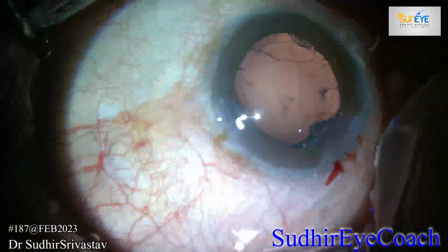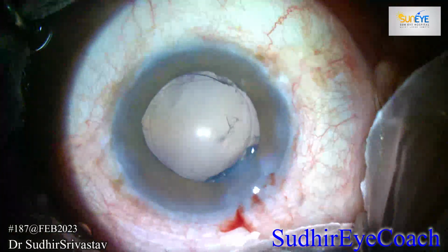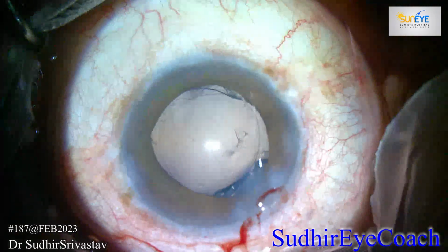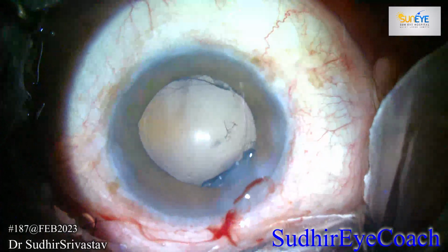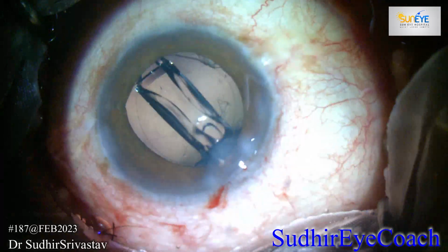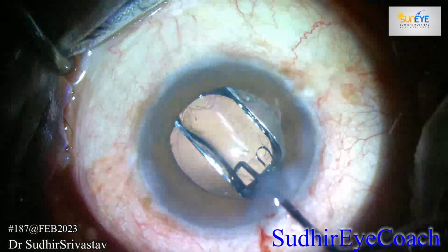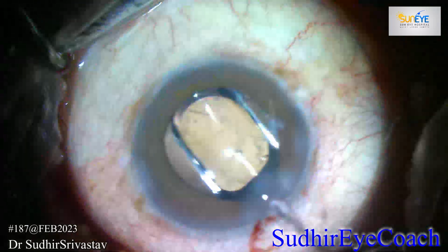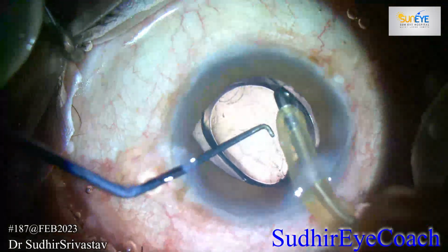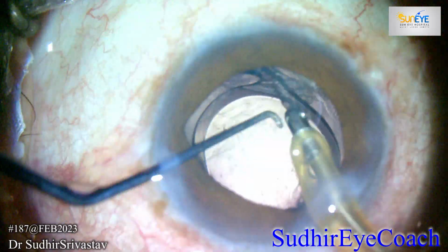Then I decided to implant the intraocular lens, and with the tensile strength of the IOL, we can stabilize the bag. That was the thought which came to my mind. So I implanted a single piece hydrophobic implant and injected it in the bag, and I kept the IOL in place where the dehiscence is, so that the haptics can give strength to the dehiscence area.